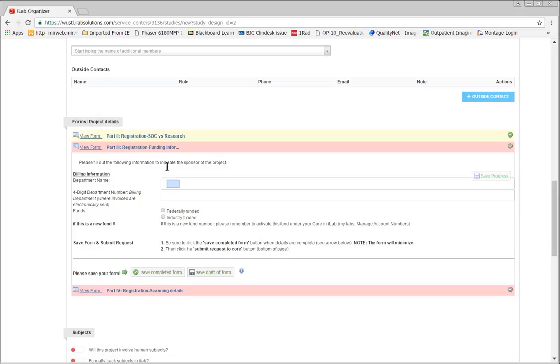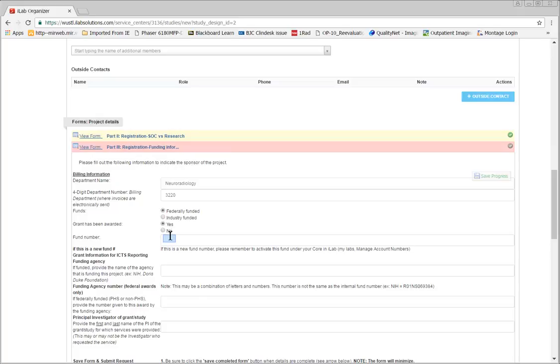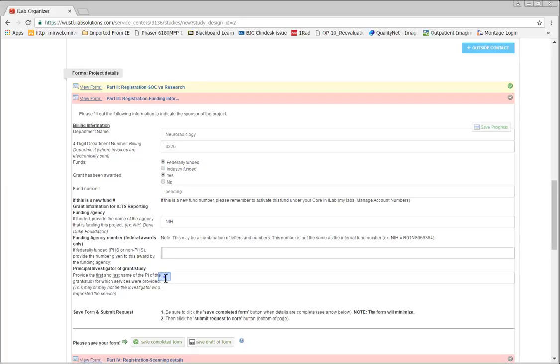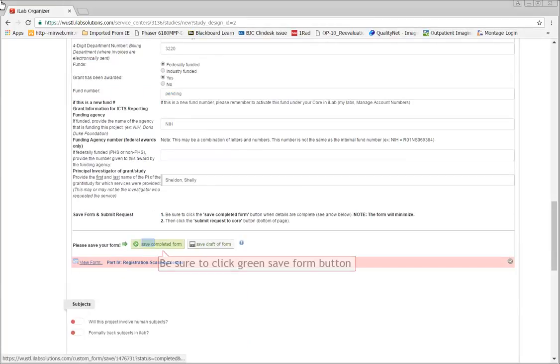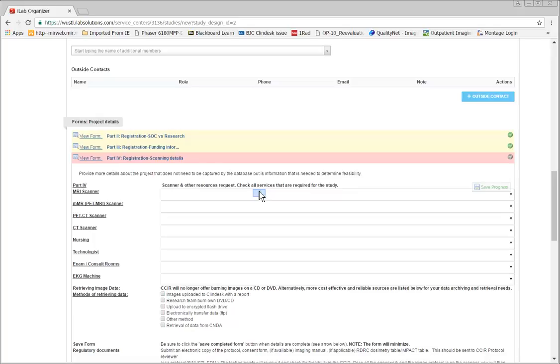In this form, we'll enter department information and funding information. Share your contract to check and select other orgs. This form describes the scanner and additional services requested.